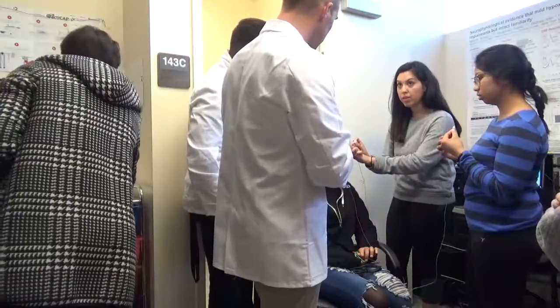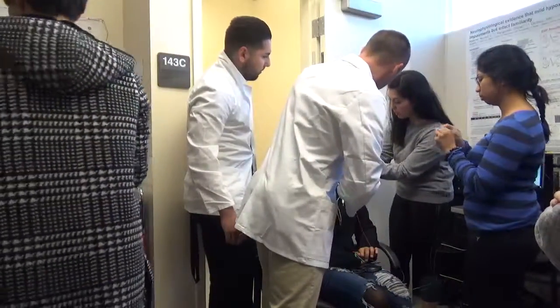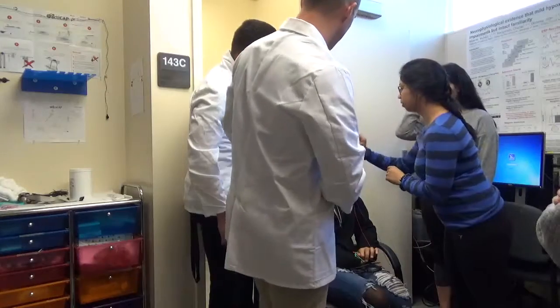Would it go on the cloth? Yeah, you can. Under the cloth. Oh, okay. We just kind of rushed ahead. Yep. Someone be above the eye. Yep. So we'll do right here.